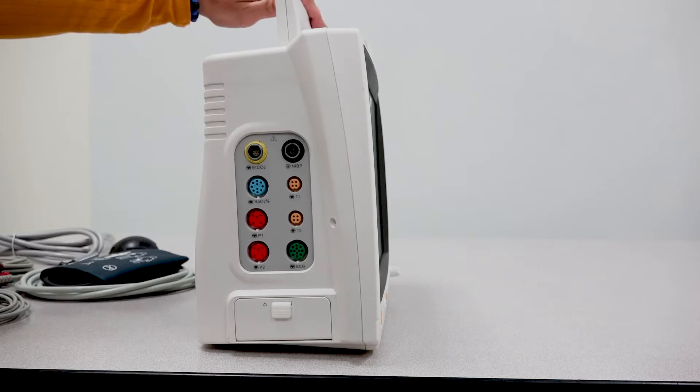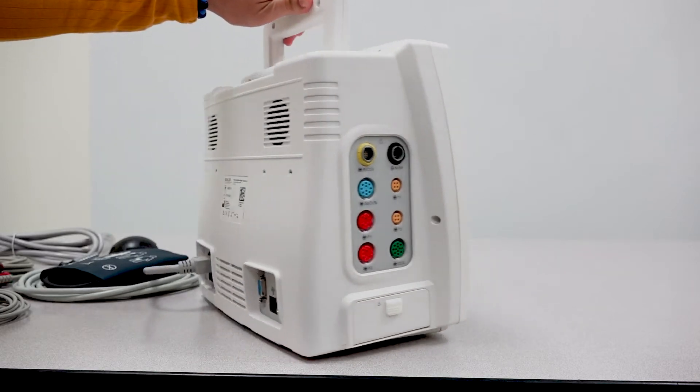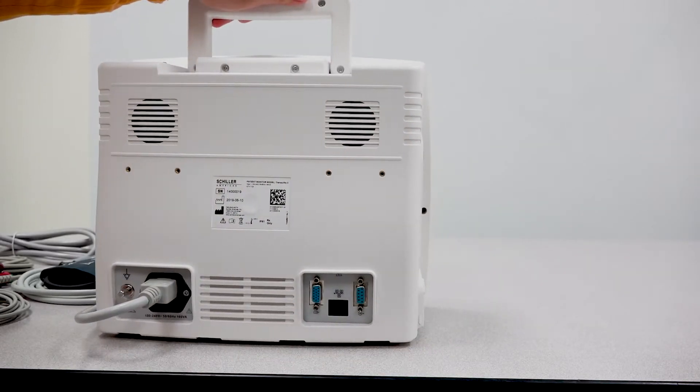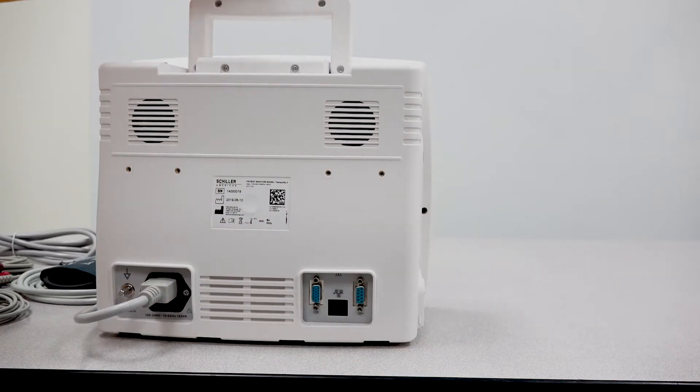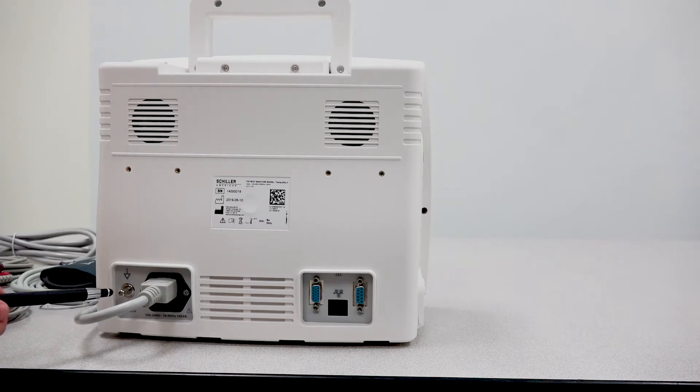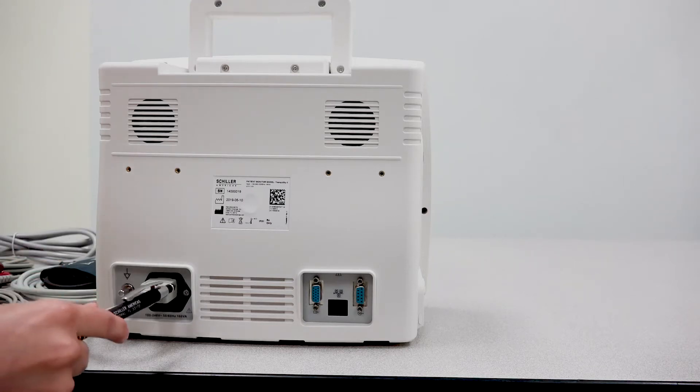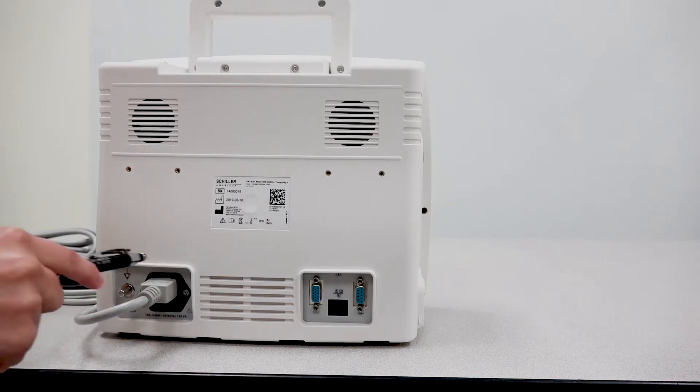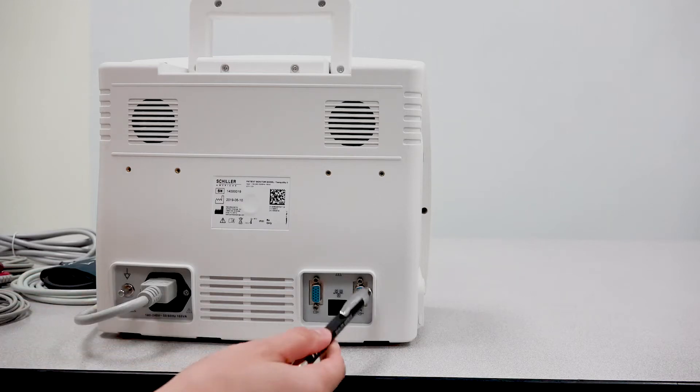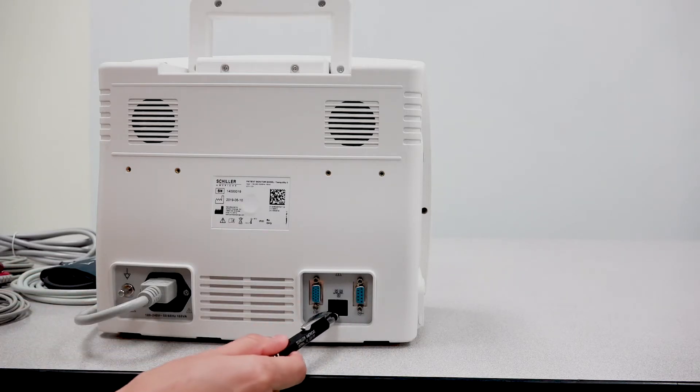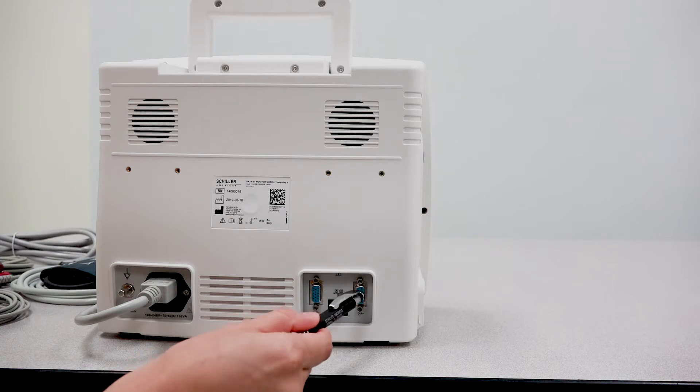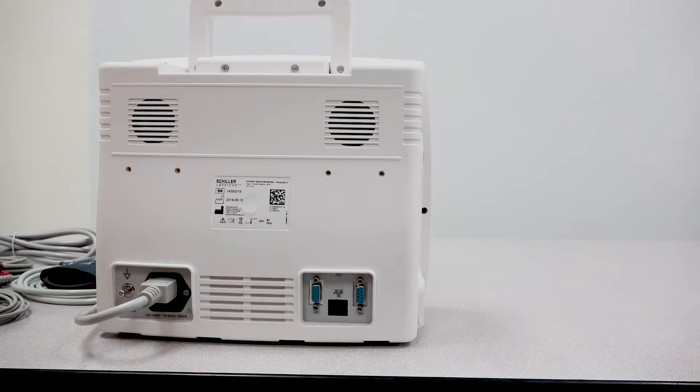Now if we flip or turn the unit to the back, you'll notice a few additional ports. You have your grounding port here, your power cord port, and then over here you have an Ethernet cable port and two RS-232 ports.